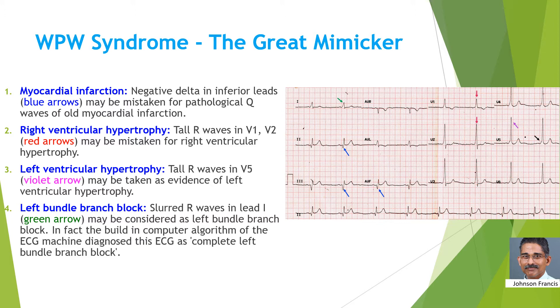Another differential diagnosis is left bundle branch block. Slurred R waves in lead 1 may be thought of as left bundle branch block. In fact, the computer algorithm of the ECG machine diagnosed this ECG as complete left bundle branch block.